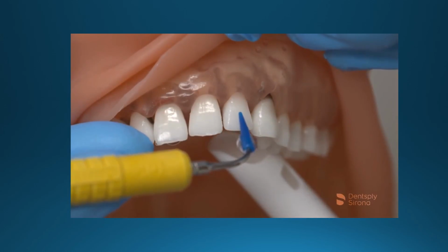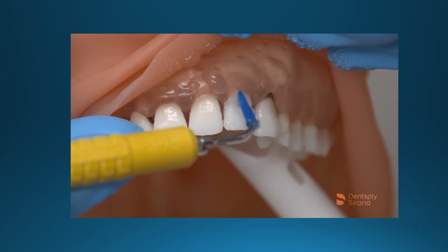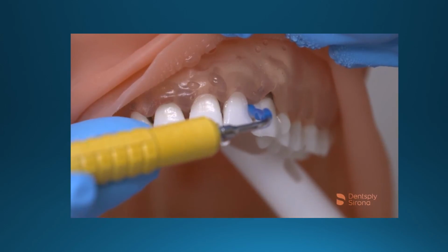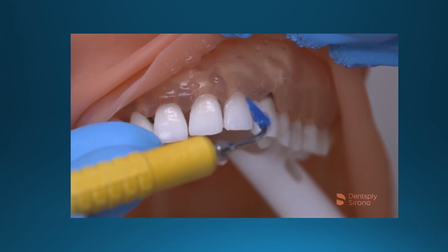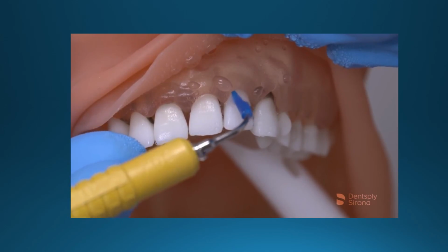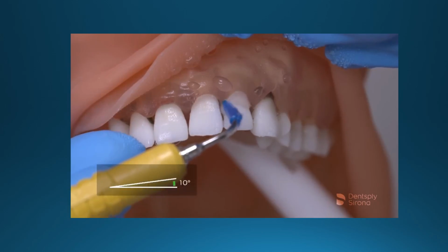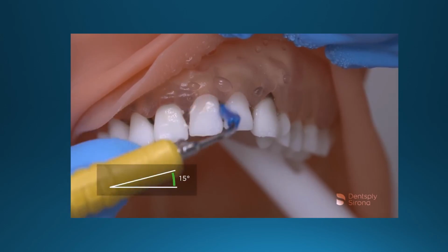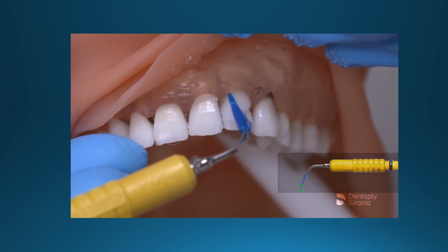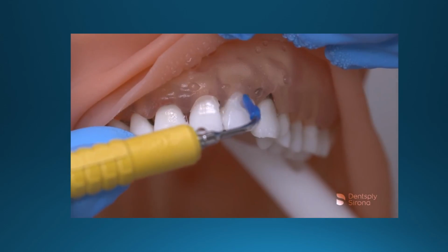Dental implants and their titanium surface need additional consideration when choosing the proper debridement instrument. The sulcular environment and the mucosal seal is more fragile than the normal tooth, and this requires a gentle approach and care when debriding in the sulcus. The insert terminal end is placed slightly subgingivally with a 0 to 15 degree angulation and 2 to 3 millimeter adaptation. Utilizing a 1 to 2 millimeter overlapping stroke will ensure thorough biofilm debridement.